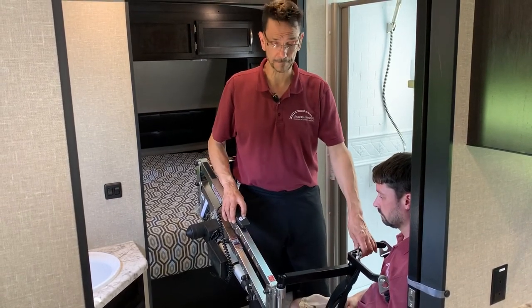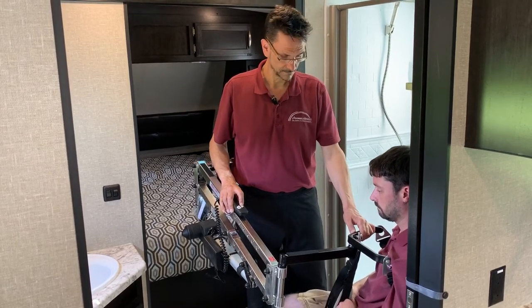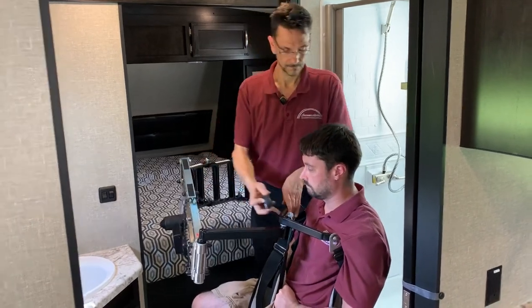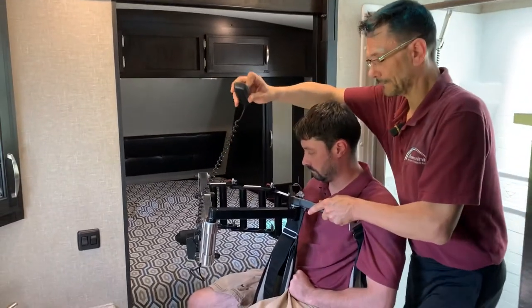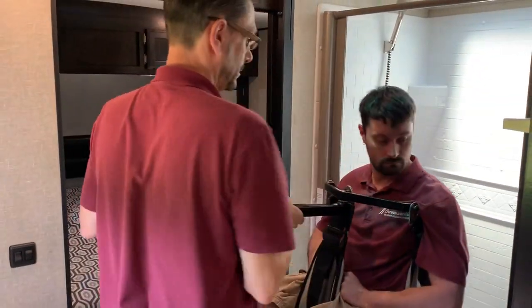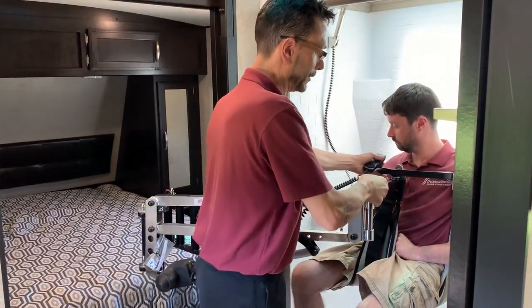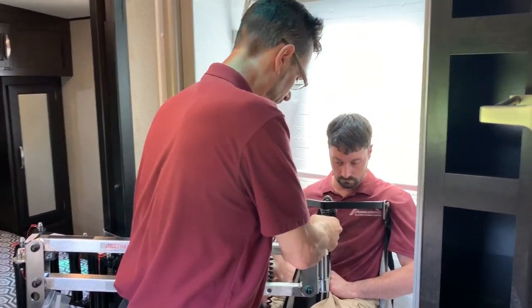Let's say we want to take a shower. Very easy to negotiate around. Now we're in the shower, down on the shower chair.